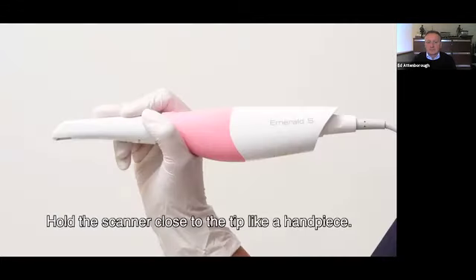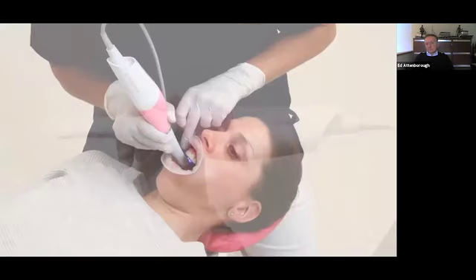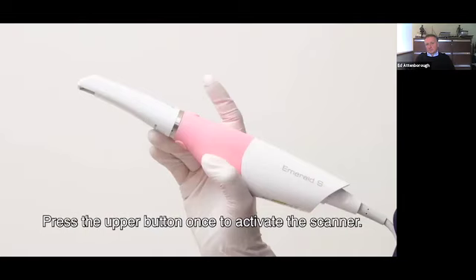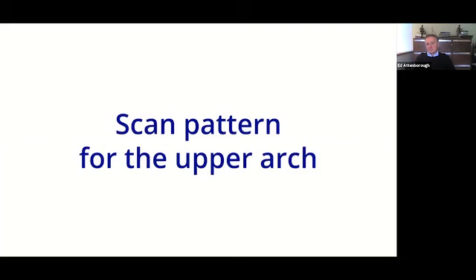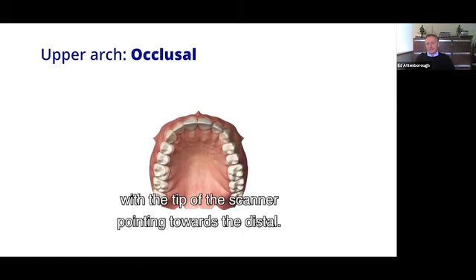Hold the scanner close to the tip like a handpiece. Rest the neck of the scanner gently on the adjacent teeth. Press the upper button once to activate the scanner. Start the scan from the occlusal surface with the tip of the scanner pointing towards the distal.